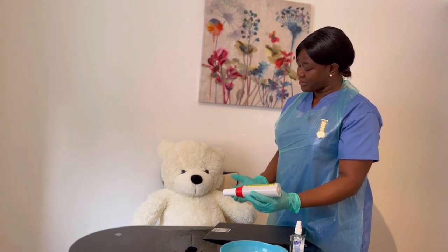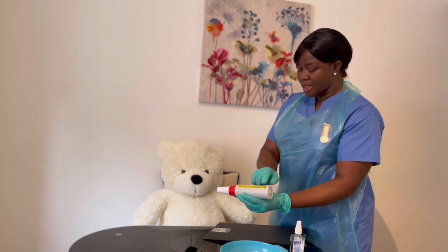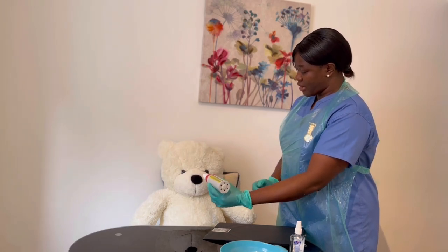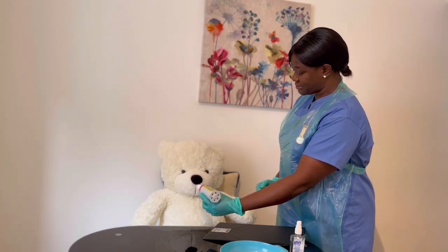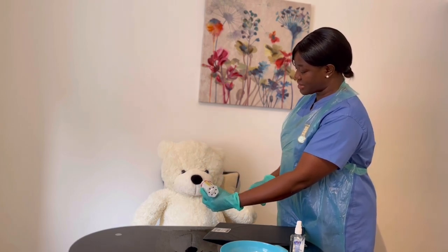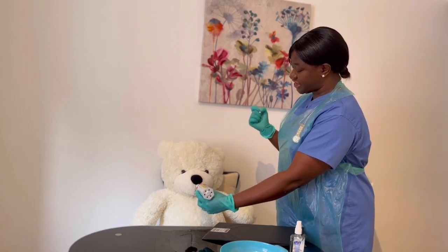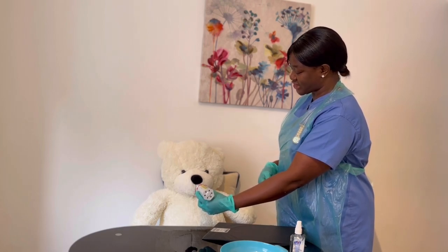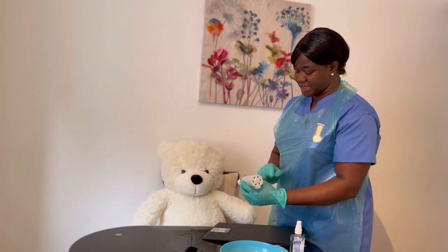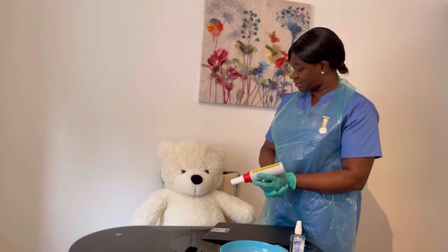Two minutes have passed. Can you take a full inspiration? Make sure your lung is filled up. The marker is back at zero level; you're holding it horizontally. Form a tight seal with your lips while still holding your breath. Can you go for the second reading — a short sharp blow, as fast as you can. Wonderful, Harry. The second reading is 610. Take a rest for two minutes.